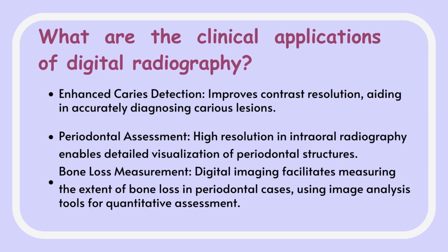And what are the clinical applications of digital radiography? So we're gonna start with enhanced caries detection. It improves contrast resolution, aiding in accurately diagnosing caries lesions.